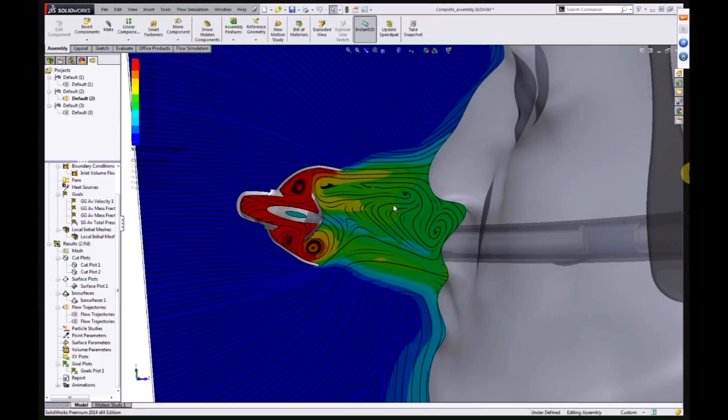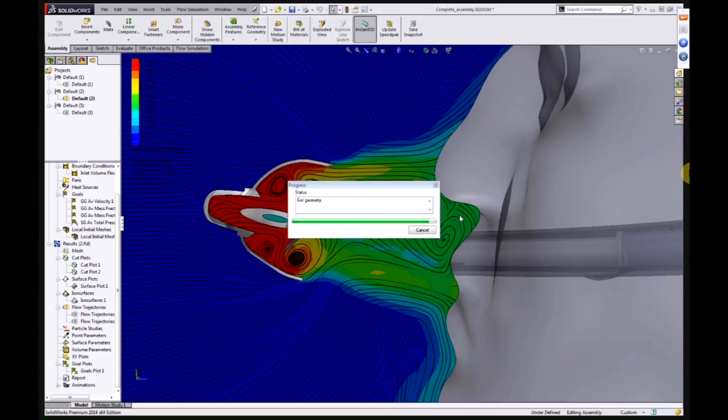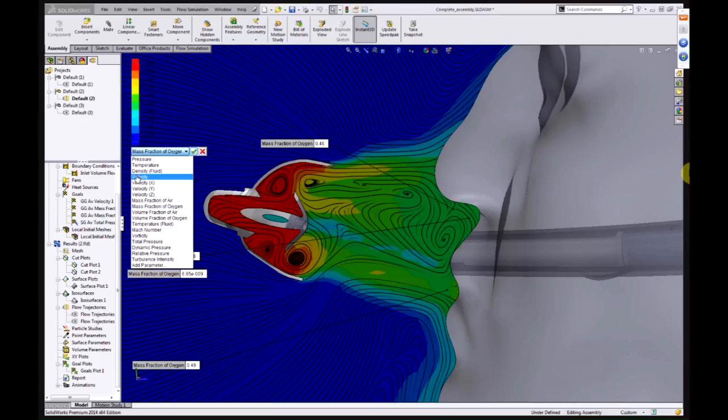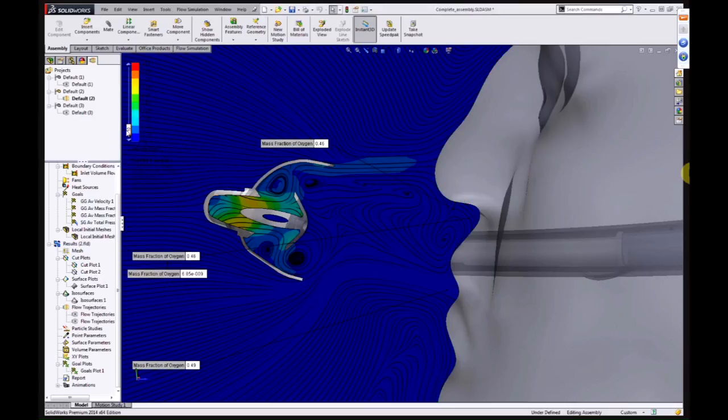That gives an idea of what these contours look like, and we can also view other parameters. So I could have a look at the velocity patterns, where we've got high velocity and where we've got low velocity. You can control the bounds on this to see some different things. We've almost got this velocity current in this particular position. It's going above the bridge of the nose, so maybe we could bring this down and angle it up more.